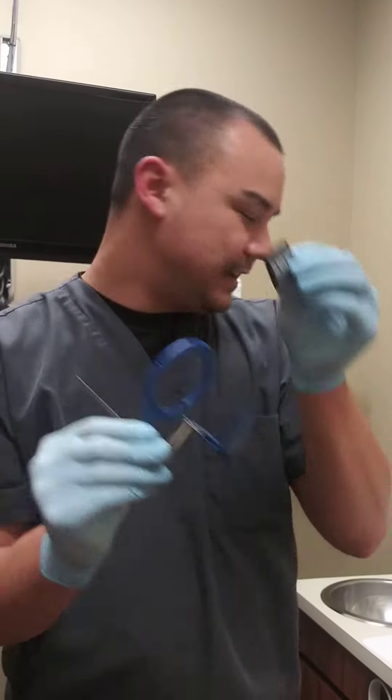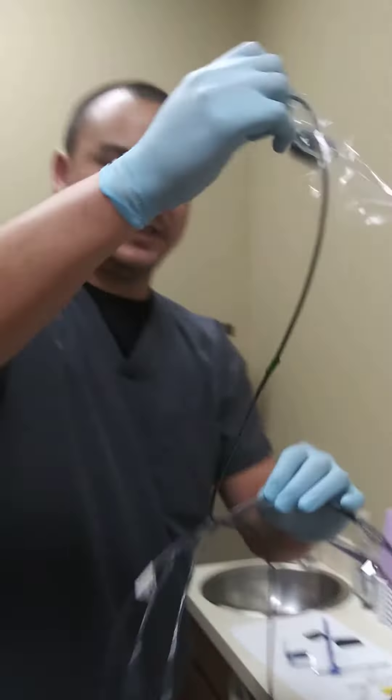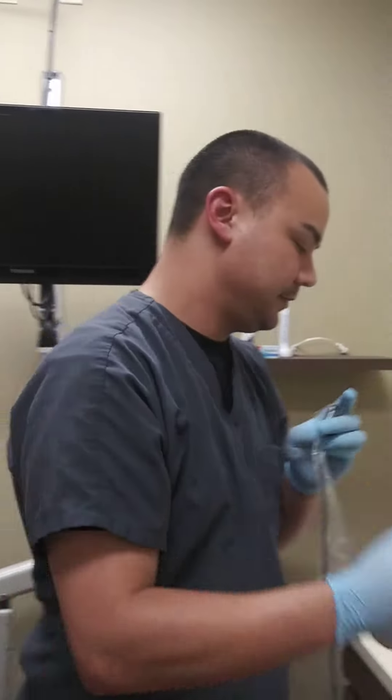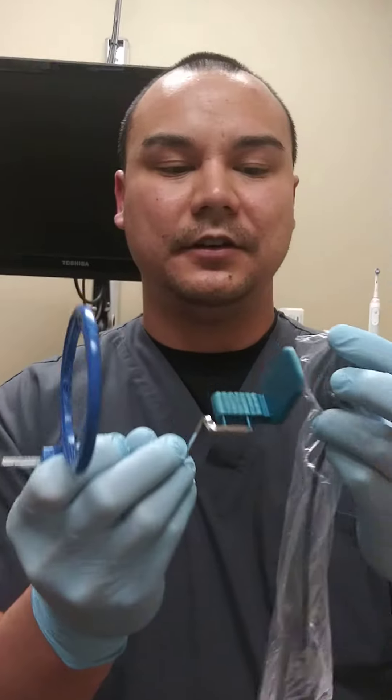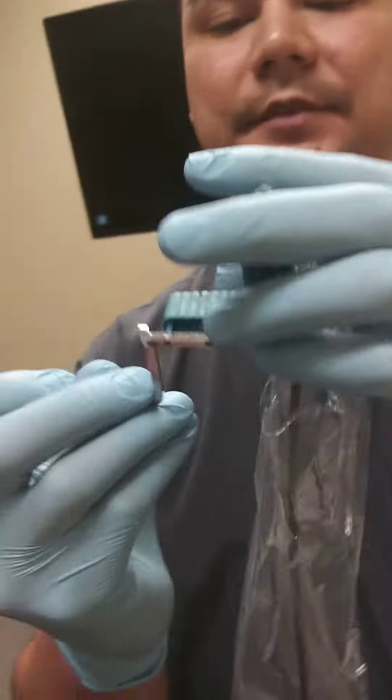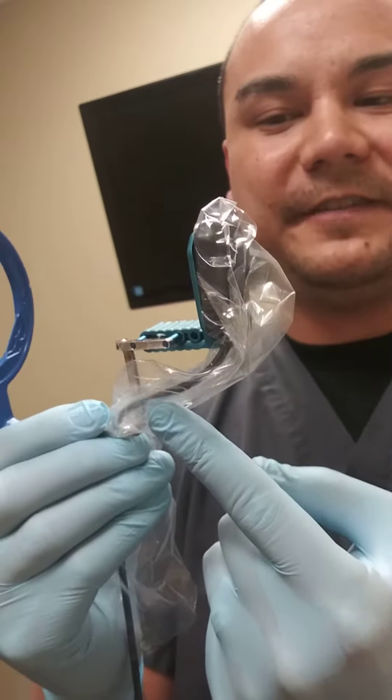And we're done with this one. Now, if you'll stick with me just a second, I'm going to do one more. This time I'm going to use the digital sensor here. Again, this one's already pre-made. We would place it here. Now the trick is going to be the cord — how to figure out how to get the cord out of your way.